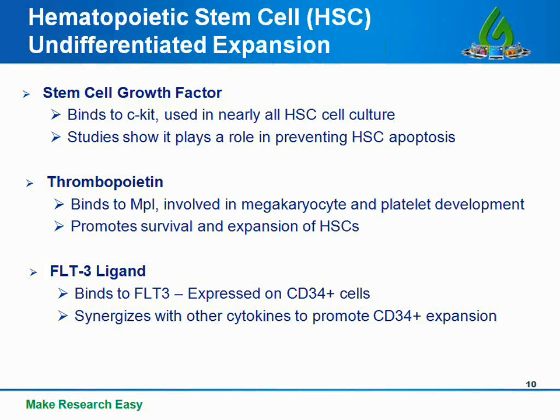Now, SCF and FLT3 ligand bind to receptors on CD34 positive cells that promote HSC expansion while inhibiting apoptosis. TPO binds the receptor involved in platelet development, and studies have shown that it synergizes with SCF in promoting healthy HSC growth. Additionally, studies demonstrate that the combination of SCF, TPO, and FLT3 ligand is critical to expanding and maintaining dendritic cell precursors. Therefore, using this combination of cytokines to expand your HSCs will help improve and optimize your dendritic cell yield even prior to beginning differentiation.